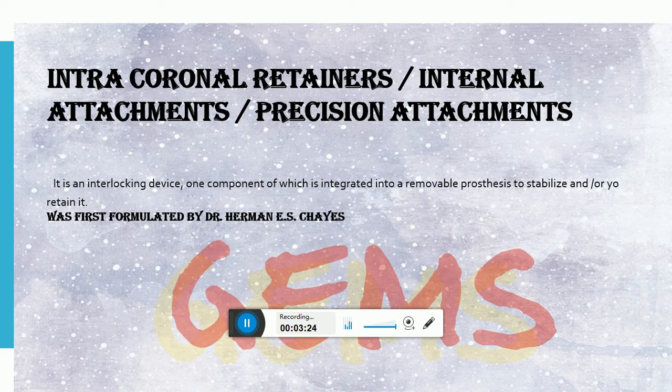It is nothing but an interlocking device, one component of which is integrated into the removable prosthesis to stabilize or to retain it.